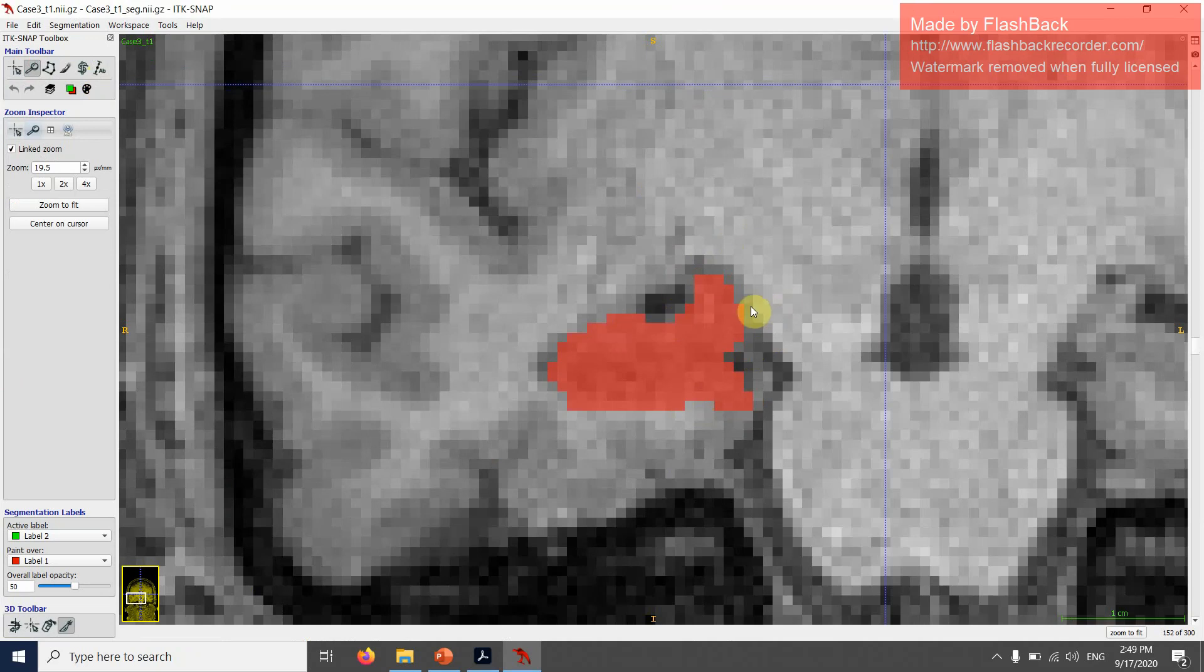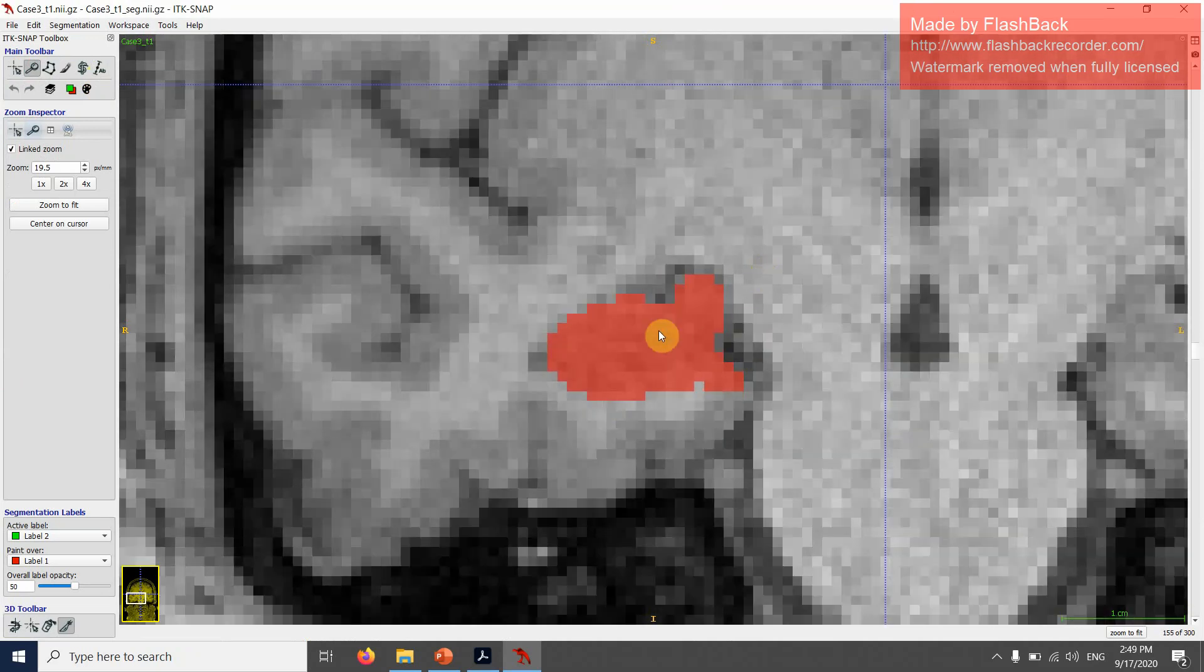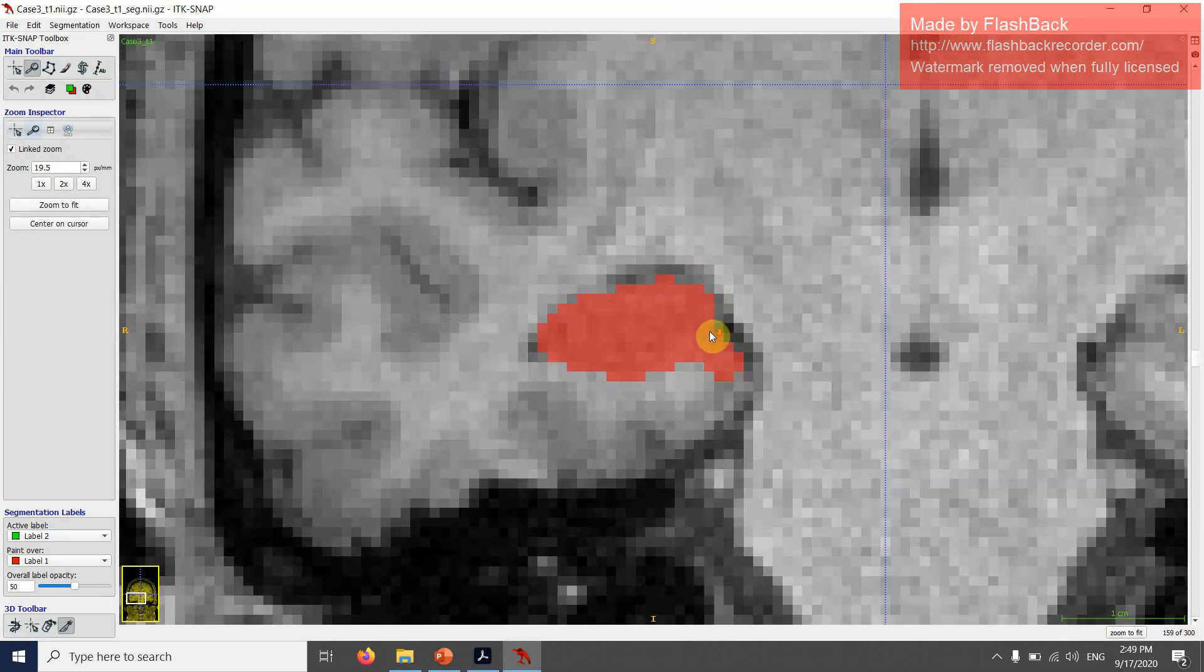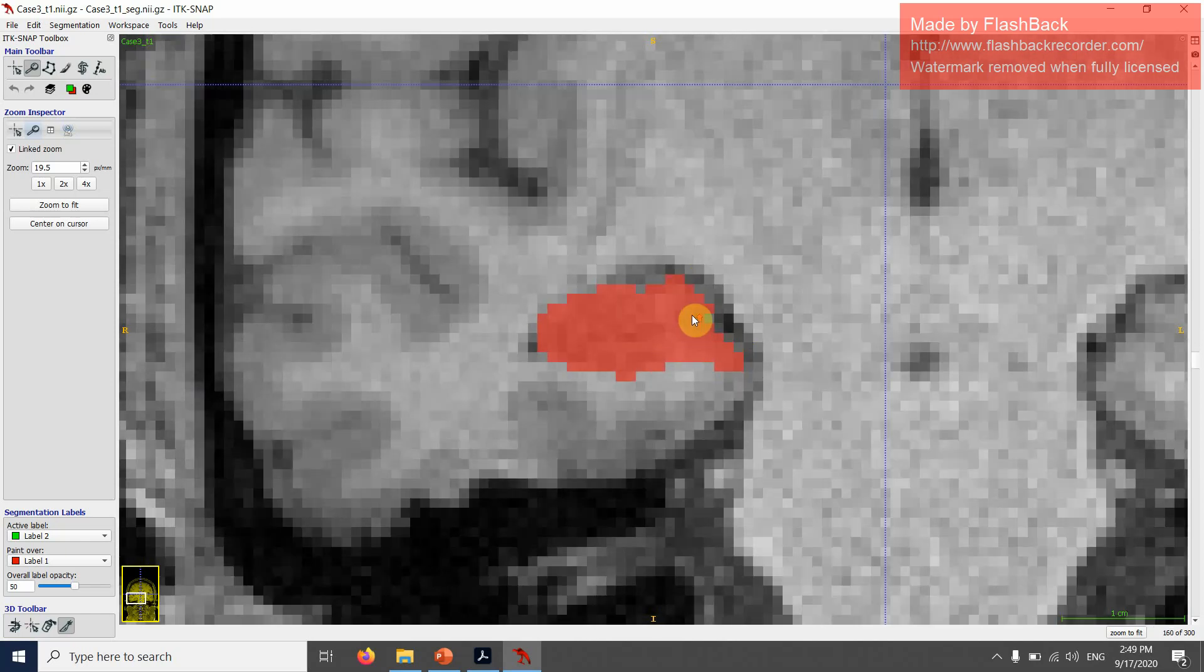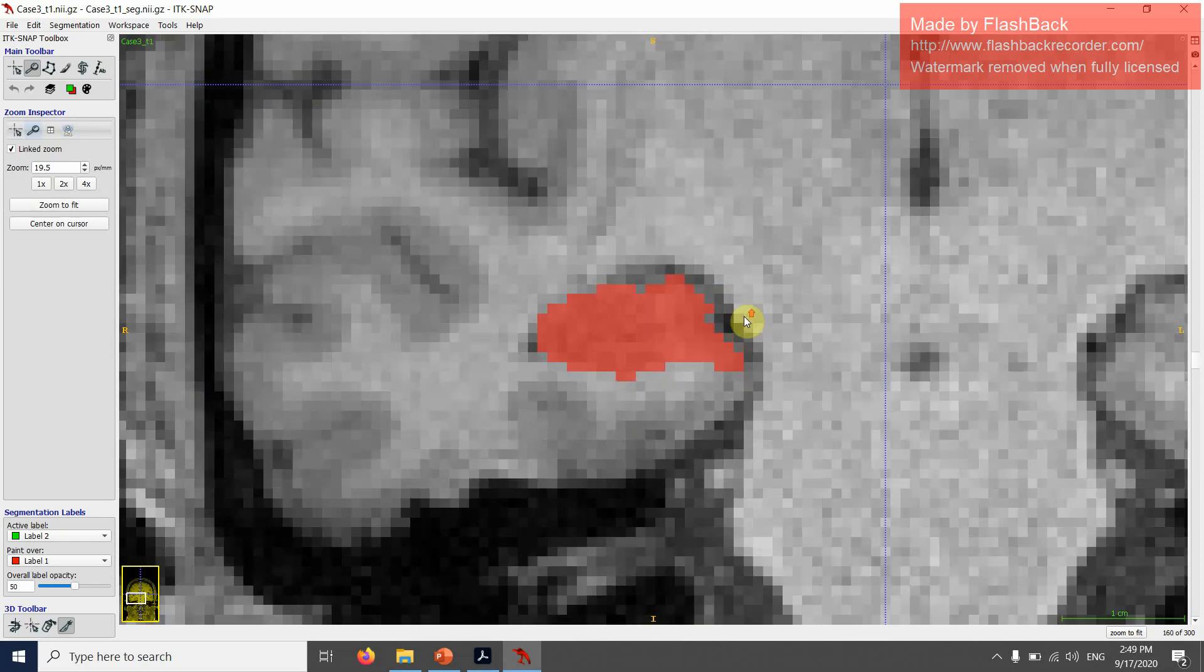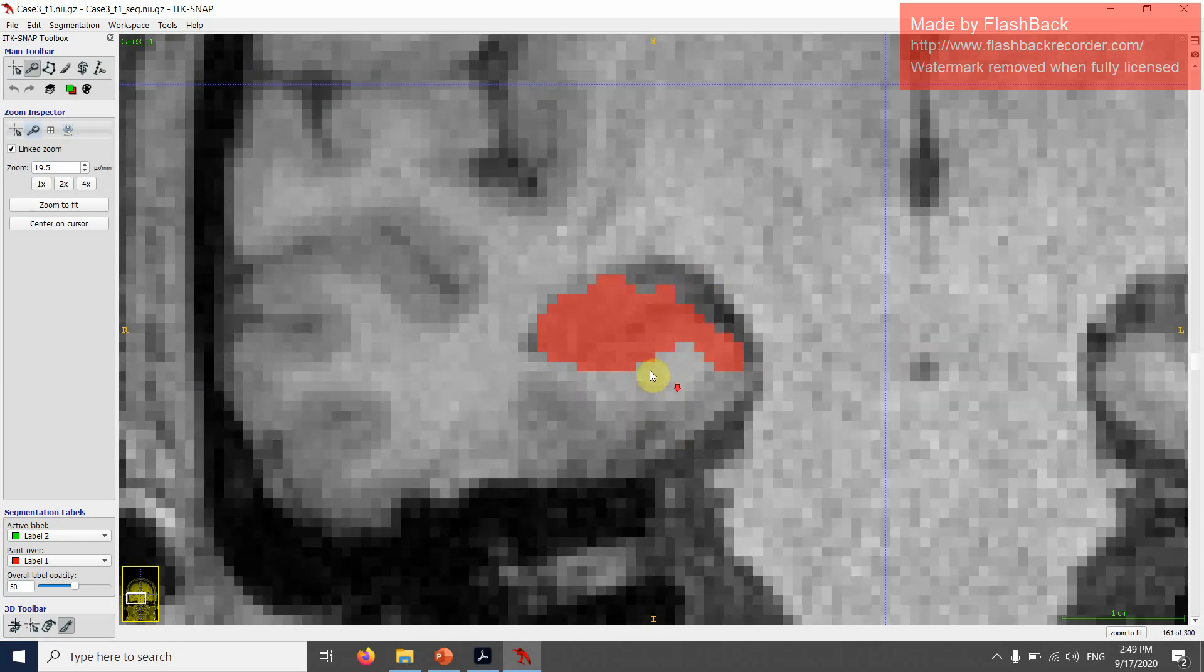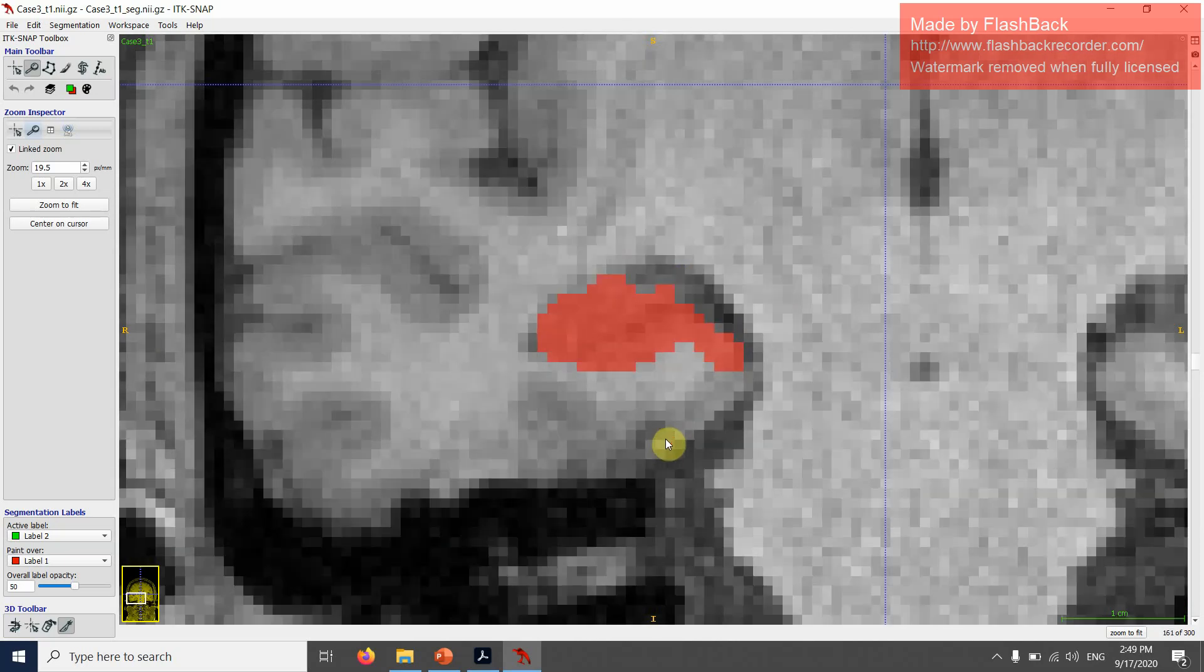Now I'm going to follow it in a posterior direction. I'm just keeping my eye on the uncus moving in the posterior direction and then you see a sudden change here from this slice to this slice. I think that's where the uncus disappears. This one actually looks a little bit different from what we've seen before. I just picked this example because sometimes the uncus doesn't become a separate region on the coronal slice. I think it's important to know that.